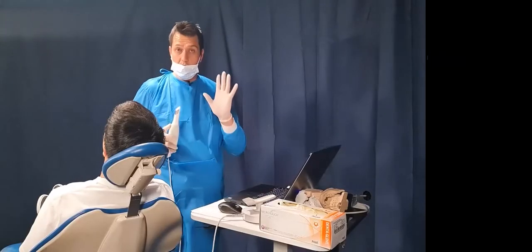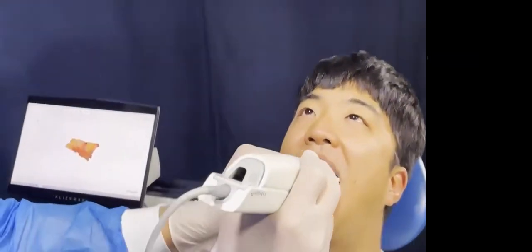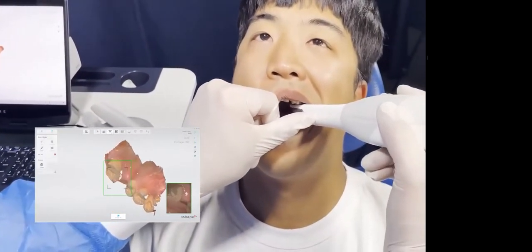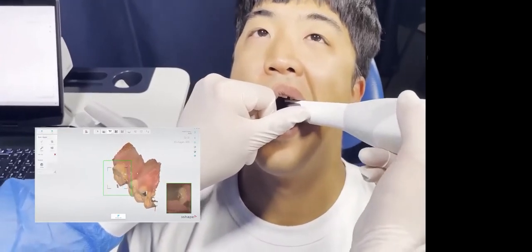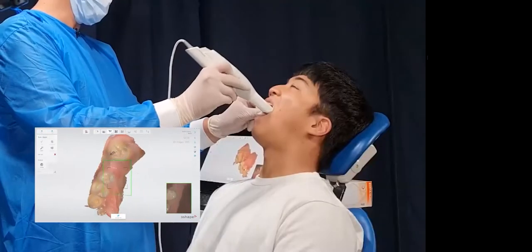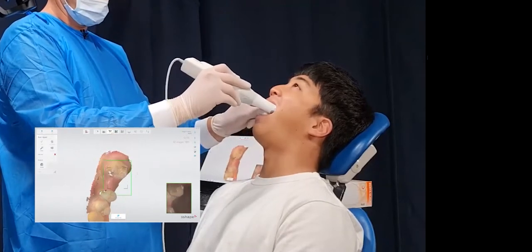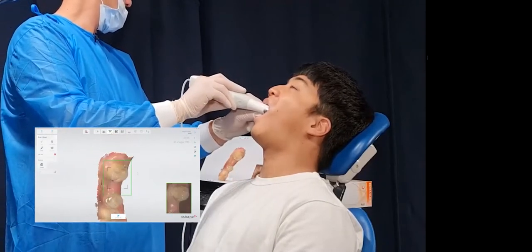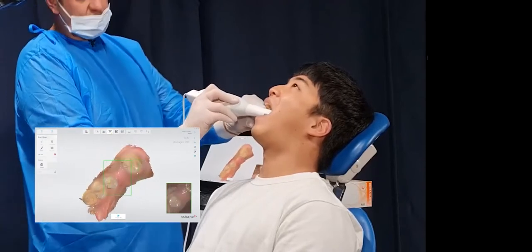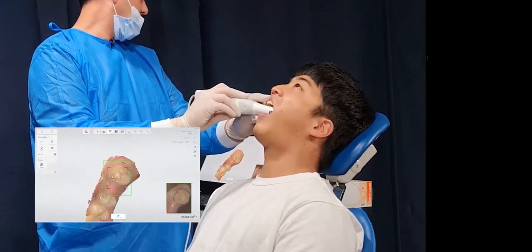So again, I'm supporting my finger, supporting my scanner head, pushing my button before I get in there, and I'm going back to my position. Now I know where I'm working, and I've actually got to rotate my scanner this way as I then rotate it that way, parallel to the place we're going. See how we're catching it? Now I'm going back this way, I'm rotating my scanner this way, and I'm going up. Up. That's a persistent one. And then sometimes you've actually almost got to go perpendicular to the patient in order to get that undercut.